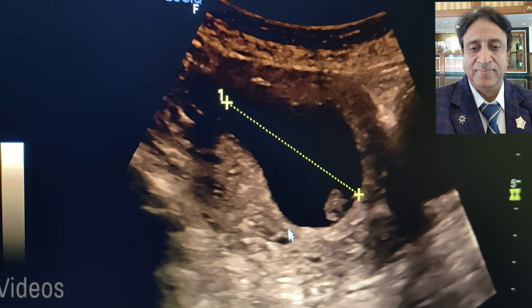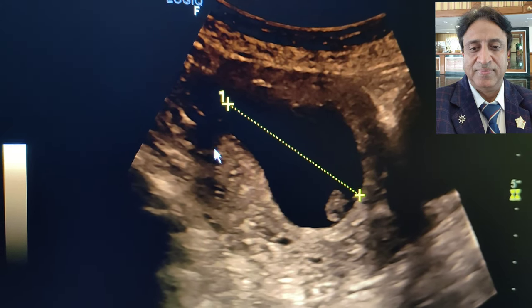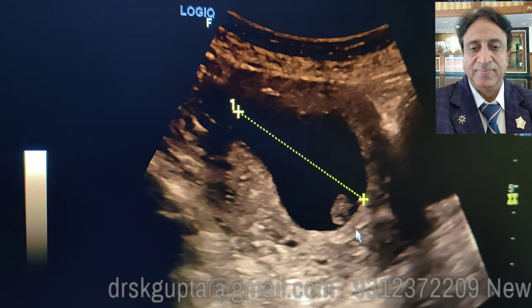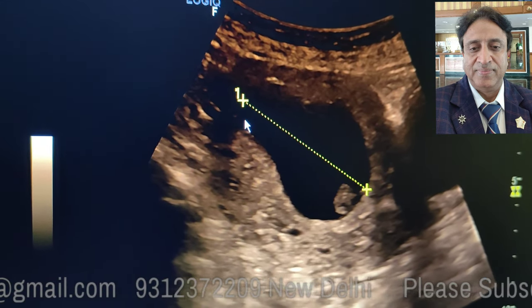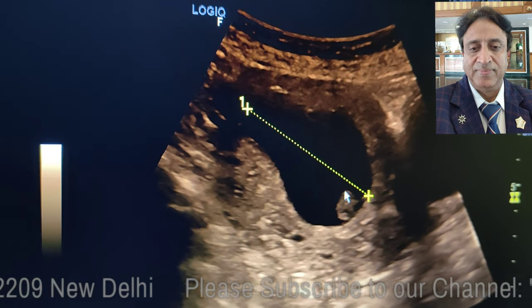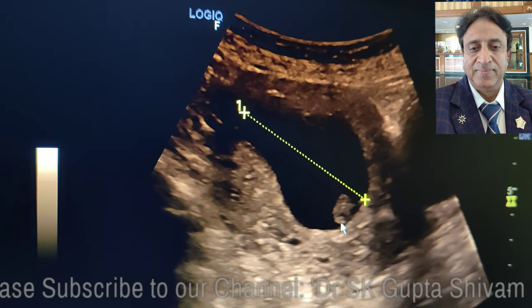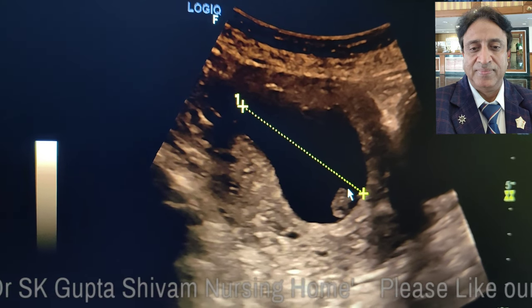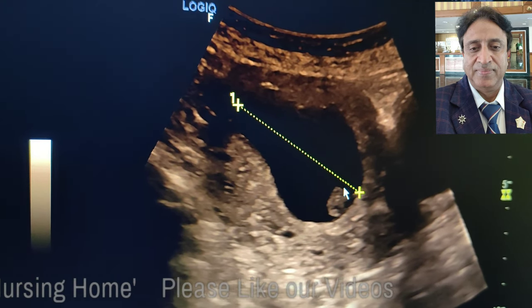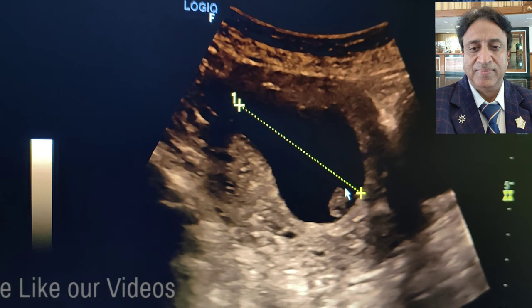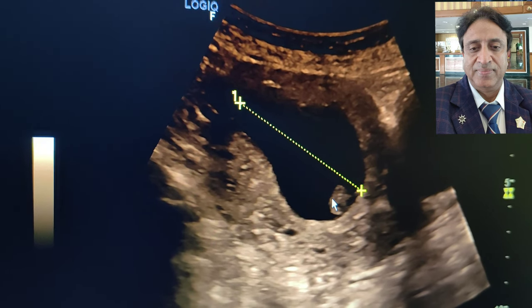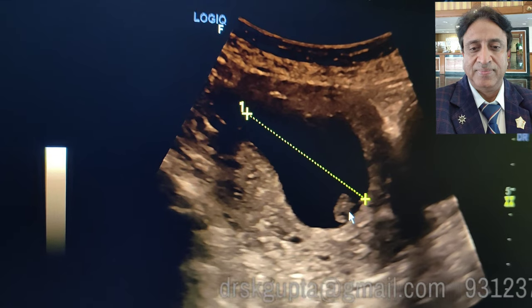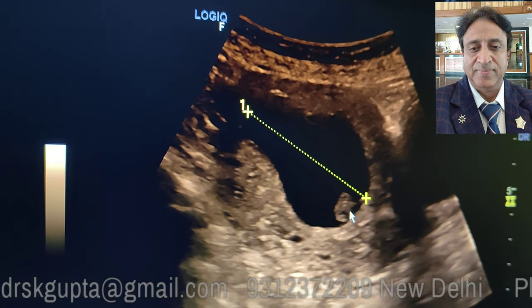Another very important feature: this sac is an elongated, irregular sac measuring about 53 mm in one direction, while the fetal pole is occupying less than 25% of the sac. Usually the fetal pole or fetus should occupy more than 50% of the gestational sac, but here it is less than 25%, which also suggests that this is a case of missed abortion.